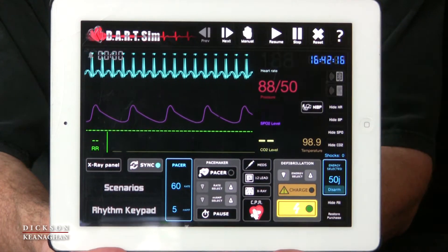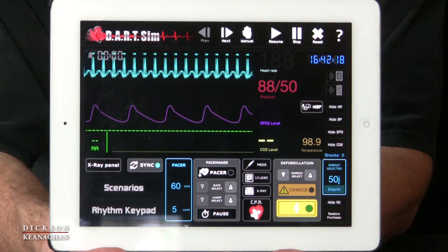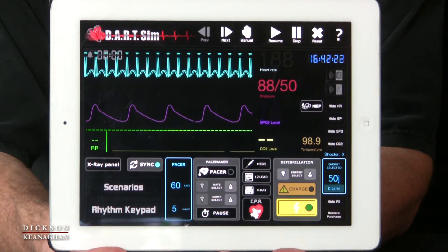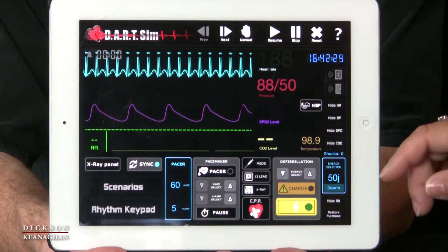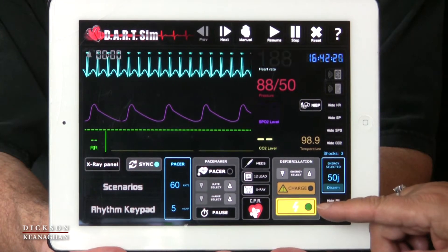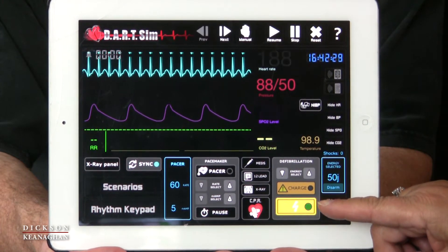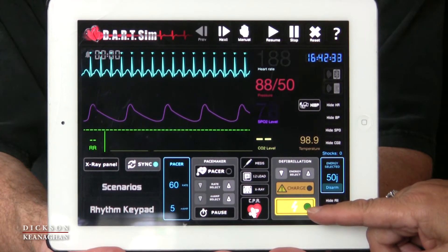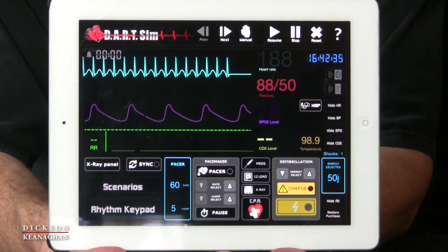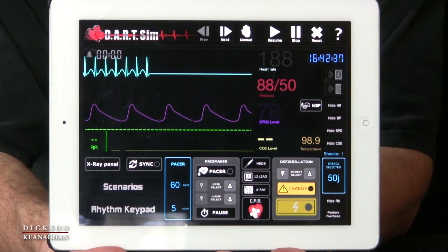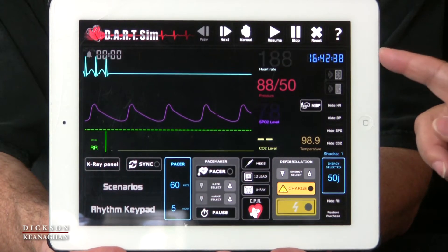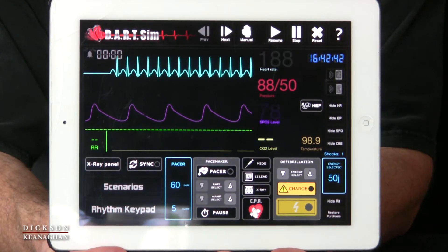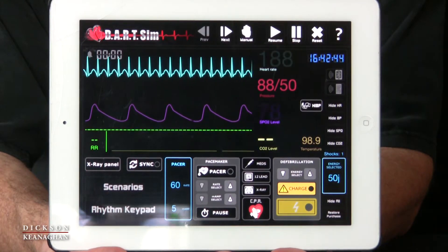And if we can sedate the patient, we will. But at that blood pressure, he might not even be very conscious. But any time I can get the team to sedate the patient, we do that. I'm going to shock on three. One, I'm clear. Two, the oxygen flow is clear. Three, everyone is clear. Shock delivered. The patient goes back into an SVT. So adenosine and the cardioversion was unsuccessful.